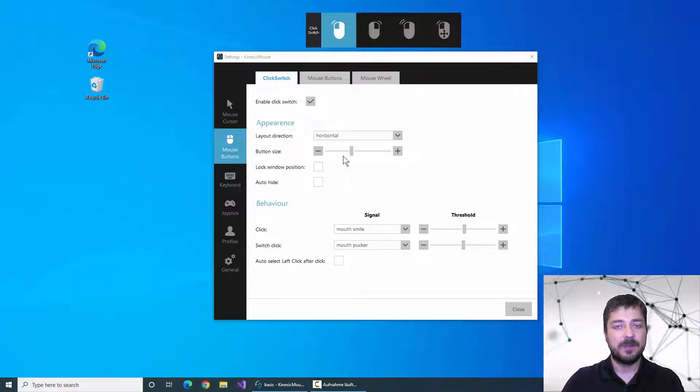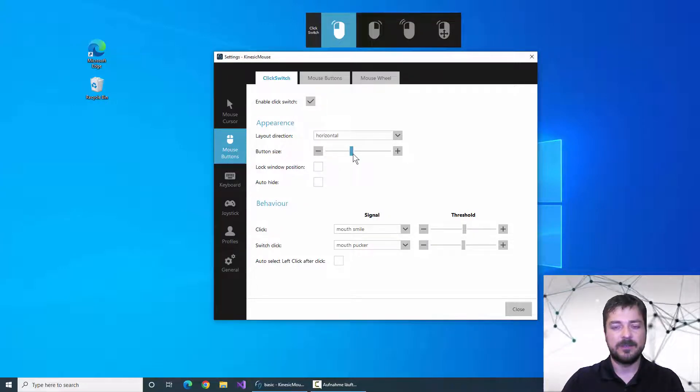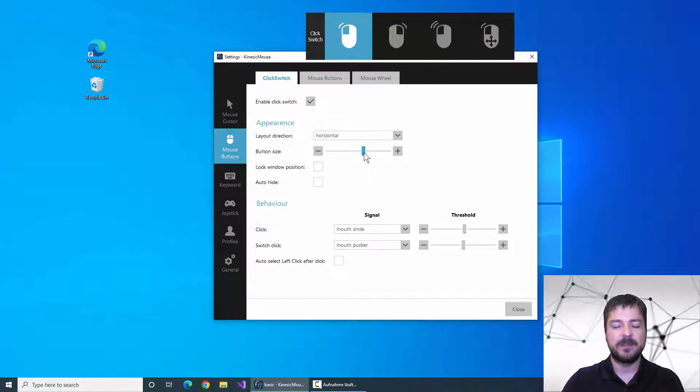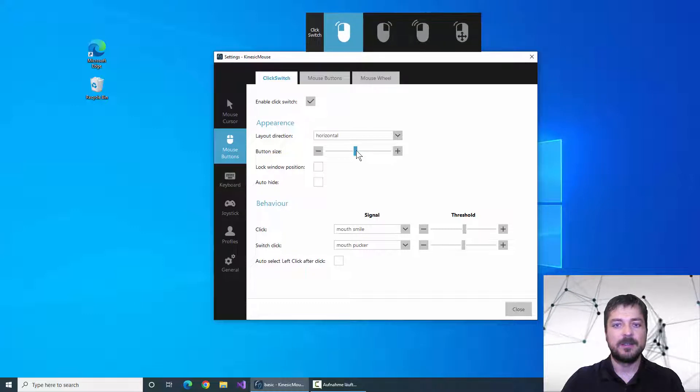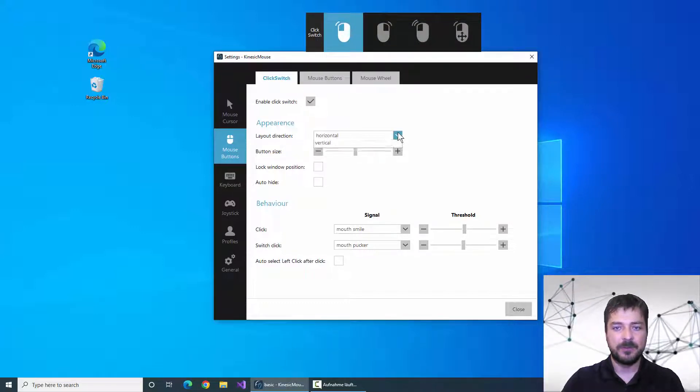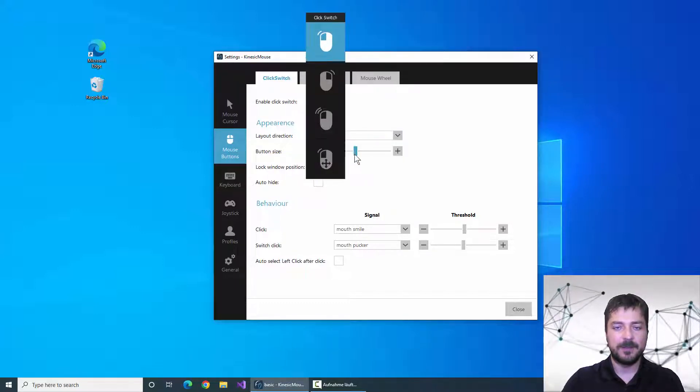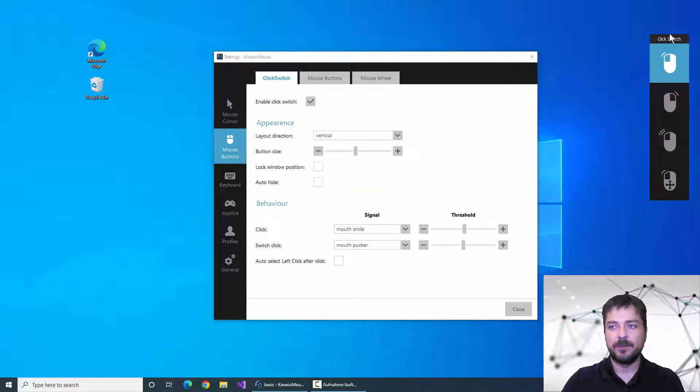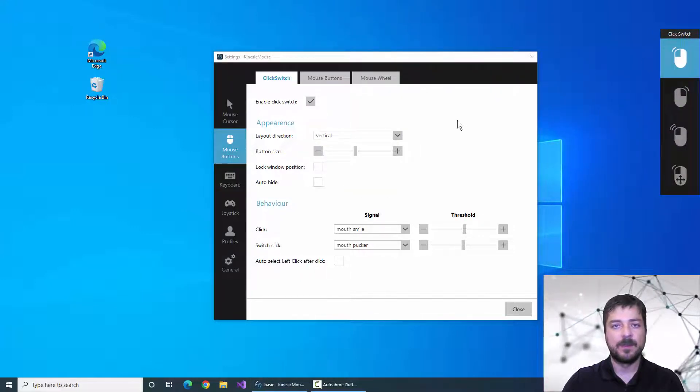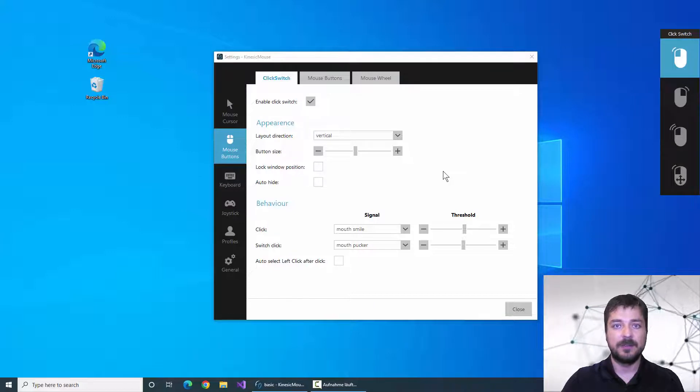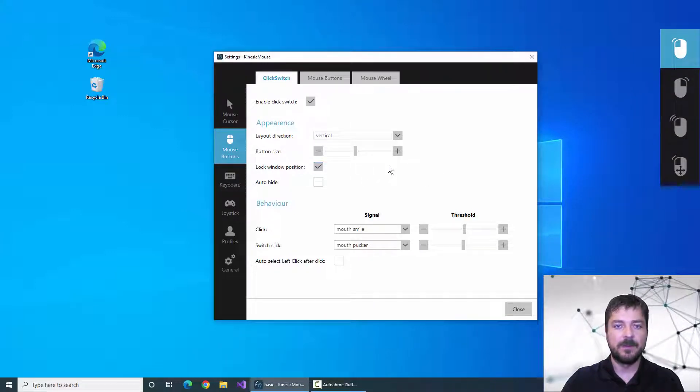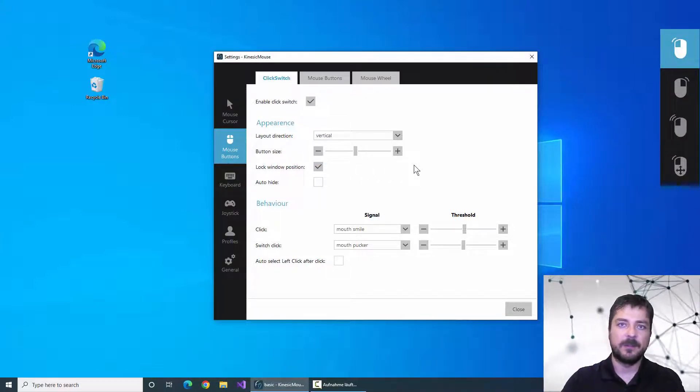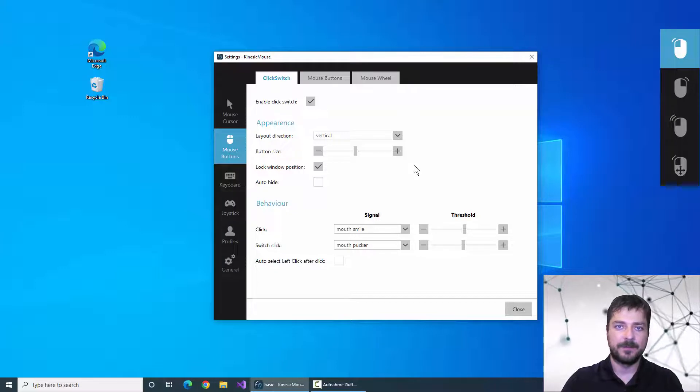If you are not satisfied with the size you can adjust the size of these buttons here in the size adjuster. I will choose a vertical alignment and move it to the right side. If I'm happy with the position I can lock the click switch menu in place to avoid any accidental movement.